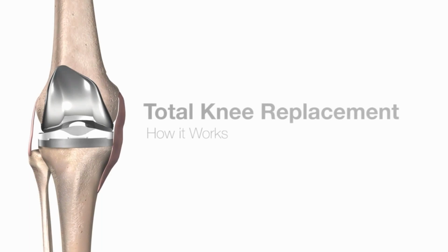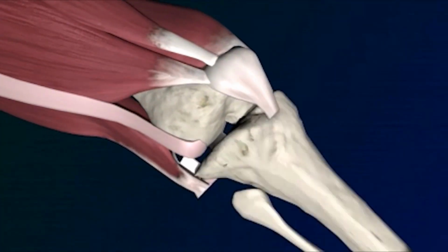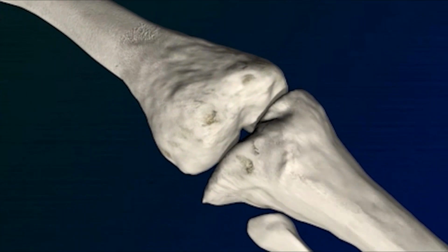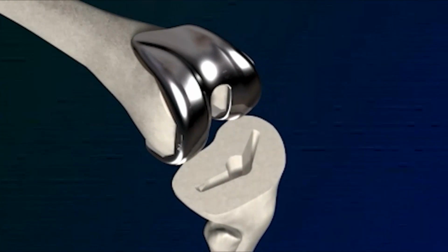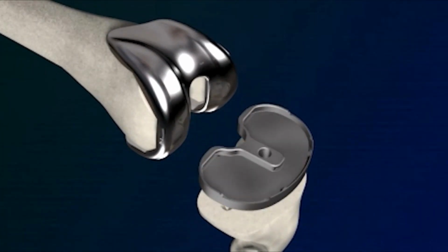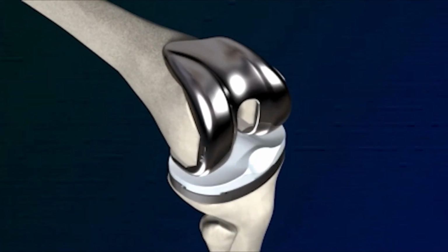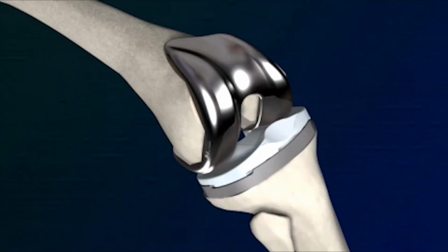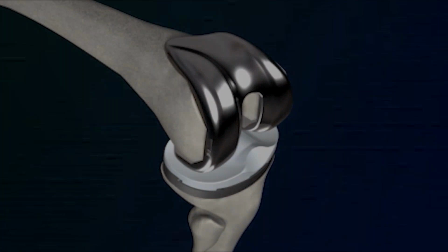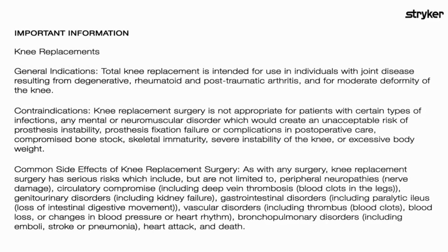We're going to see a little video here and that sort of shows what we do in a knee replacement, whether we do it with the robot or not. So you can see that we basically just shave the edge of that bone and we shave the top of the tibia bone and we replace that with metal, or resurface that with metal, and we put a plastic in between there. So that's all we're doing in a knee replacement. We're really not taking anything much more than that. We save all the ligaments, the tendons around the knee, and all the soft tissues are still in place.